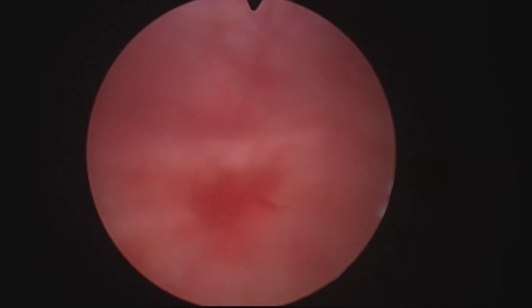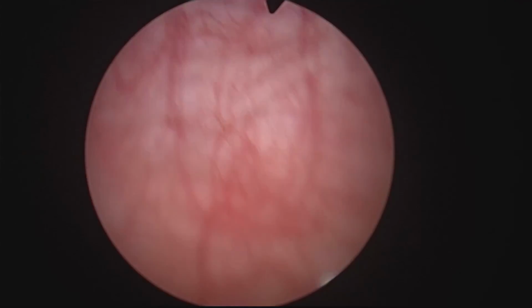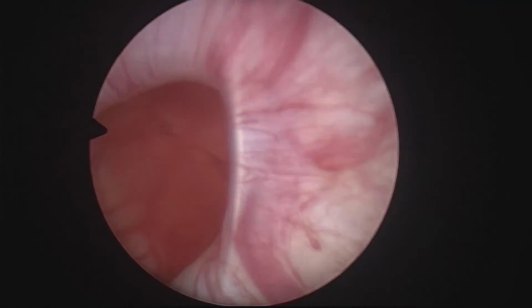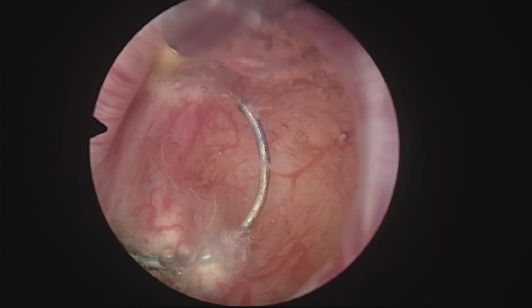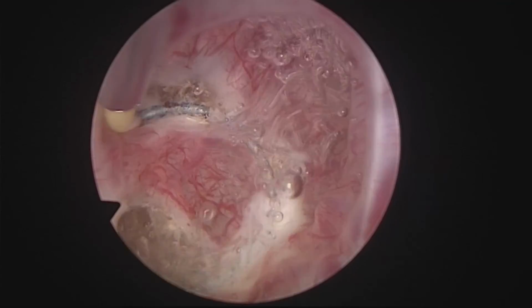There were some stones there, so I did the same maneuver again, just removing, you see, the inner sheath, closing the inflow and letting the gravity or the outflow, the water from the bladder, take out these remaining stones. Searching for other diverticulums. This is the one that I already treated. There's a small one there that I lost. This is another one, so I'm going to try to do the same here to see if we reduce these diverticulums. And I hope it works.